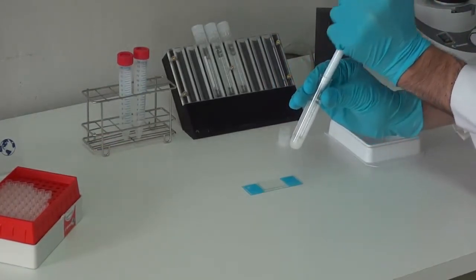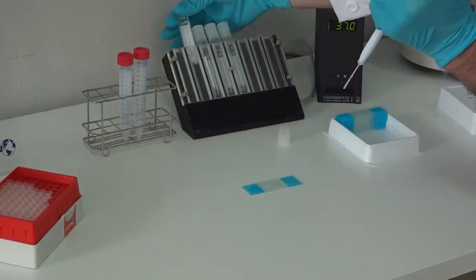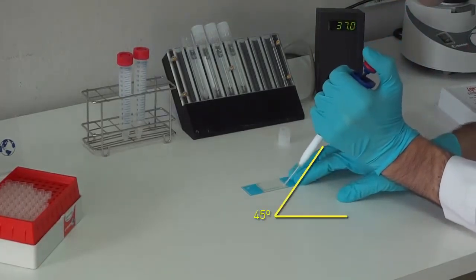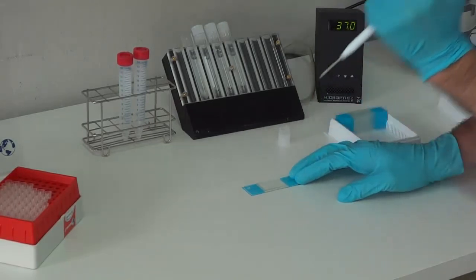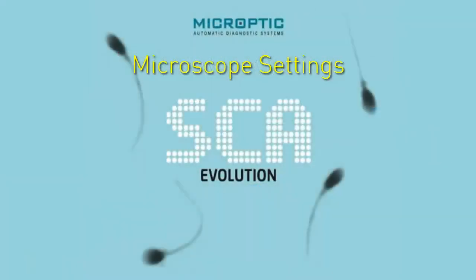Load the sample, placing the tip in one of the filling spots. Observe as the filling front has reached the outstream opening of the chamber. Then remove excess fluid. The slide is ready to be analyzed.